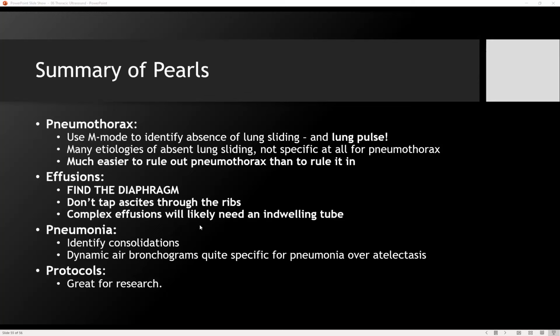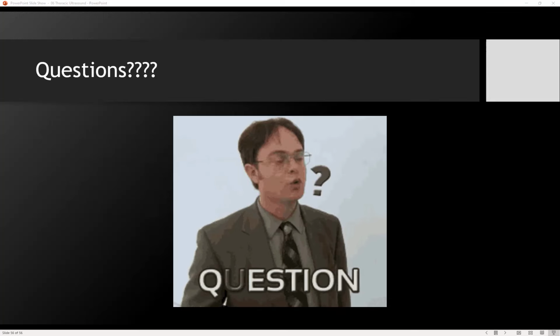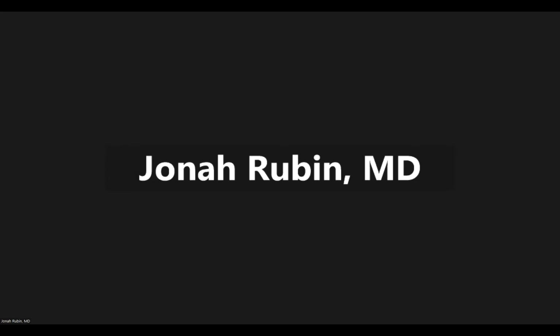And protocols, I think, are great for research, but perhaps less helpful clinically when you understand what you're seeing in your patient's context. So thank you all for participating. Hopefully you learned something, and I'm available for any thoughts or questions or anything else anyone wants to add.